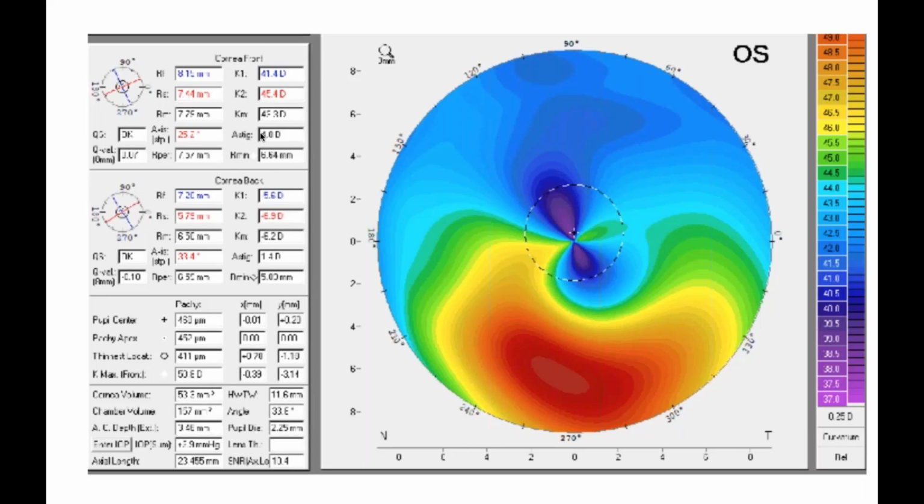So we have one more last-minute question here, which I think is worth clarifying. And that is when you're talking about ocular corneal aberrations or whole eye aberrations. So you're just considering the corneal HOAs or the whole eye HOAs? Well, there's a couple different ways to get entire eye higher order aberrations. One is a staphyloma or some type of irregularity in the retina, which you should have diagnosed in your workup. And then the other one is aberrations within the natural lens, which we are by default removing in cataract surgery, which is kind of what this talk is about.